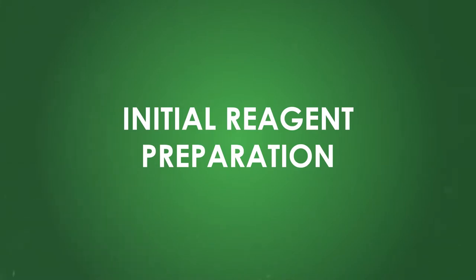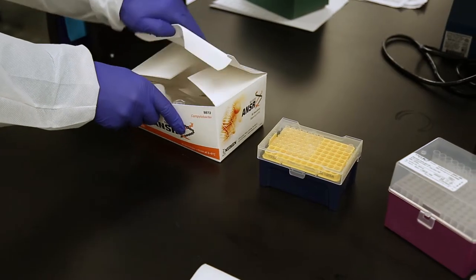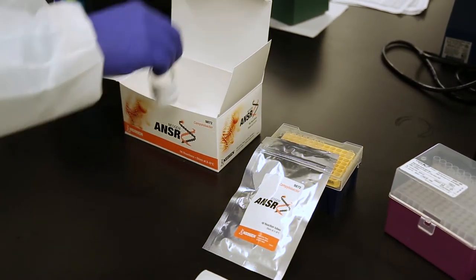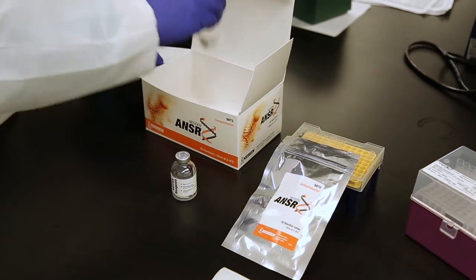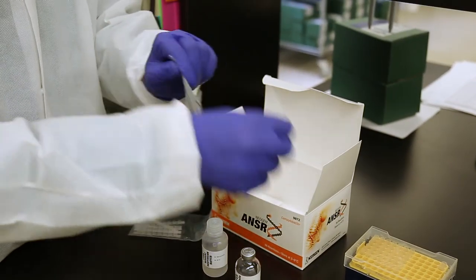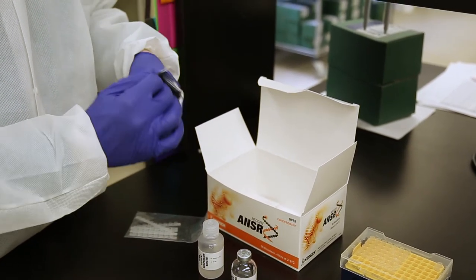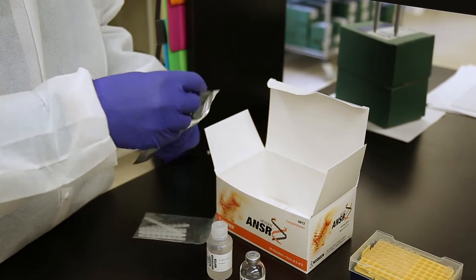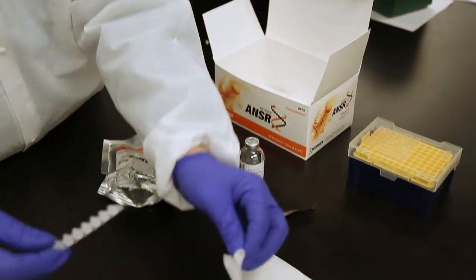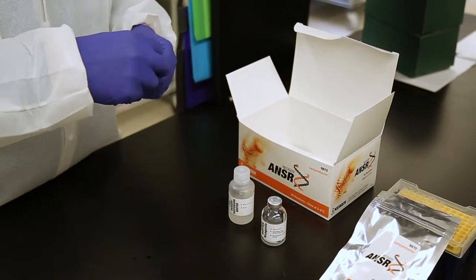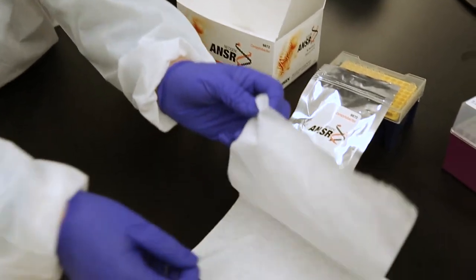Initial reagent preparation. Prior to running the kit, the lyophilized lysis reagent, lysis reagent suspension buffer, and appropriate number of reaction tubes need to rest at room temperature for at least 15 minutes. We are running eight samples today, so we've removed one strip from a foil pouch and placed it under a paper towel to protect the samples from excessive light exposure. You should also place one set of permanent caps under the paper towel. Unused supplies should be returned to refrigeration immediately.